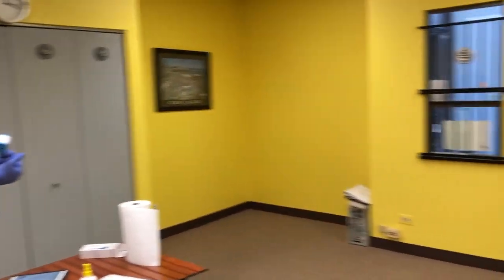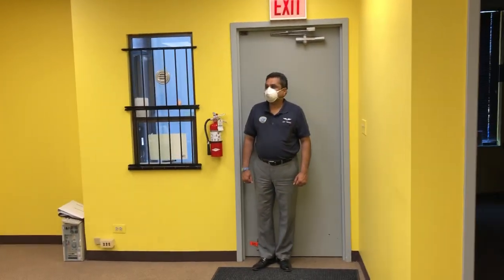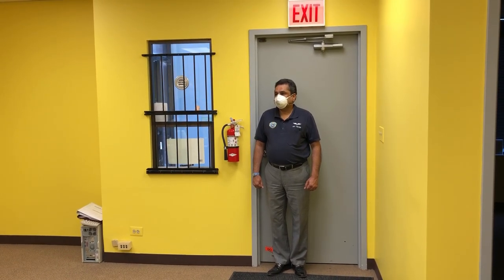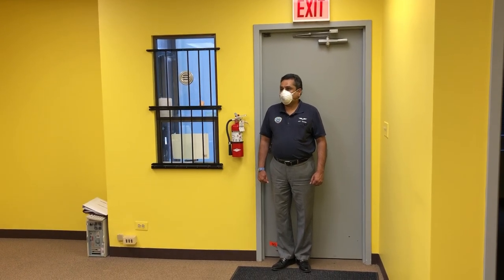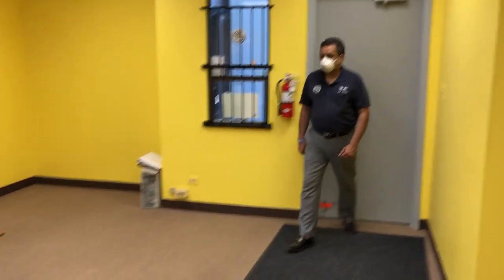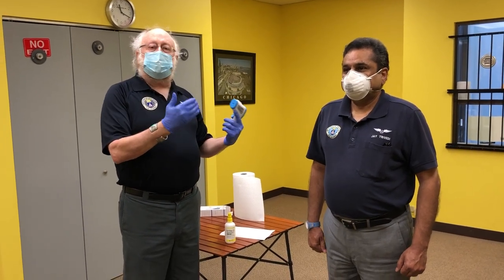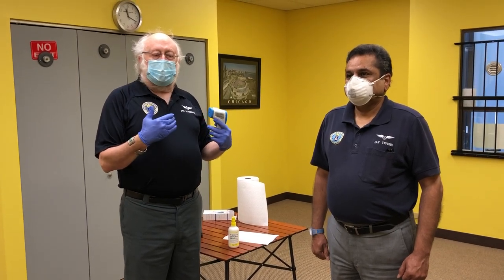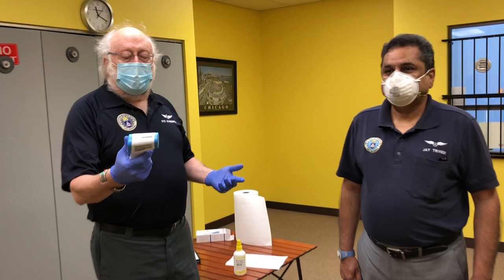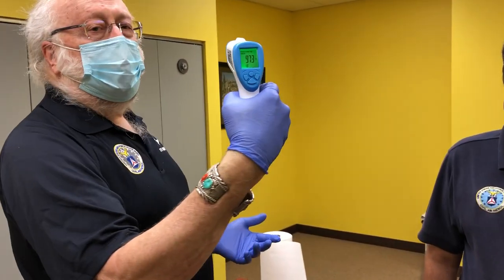This member has just walked in the door and will identify himself. 'Major Trivedi requesting permission, sir.' Okay Major Trivedi, thank you. Have you been feeling well? 'Very well, sir.' Any cough or respiratory symptoms? 'No sir.' Have you been around anybody with diagnosed COVID-19 disease? 'Not that I'm aware of, sir.' Any change in your sense of smell or change in your sense of taste? 'No sir.' Please approach the table for temperature screening and look over there — you don't want the member facing you in case they cough. Having them at 90 degrees to you is good. Then you take the thermometer and squeeze the trigger twice — 97.3 degrees.